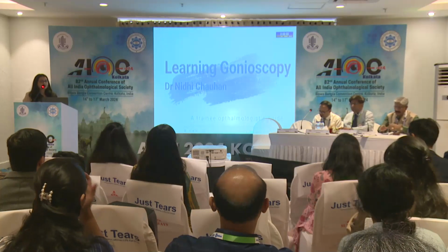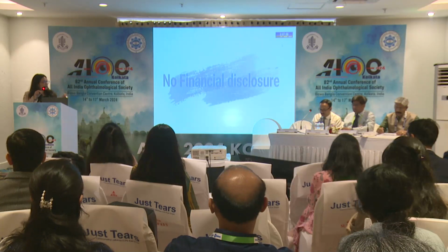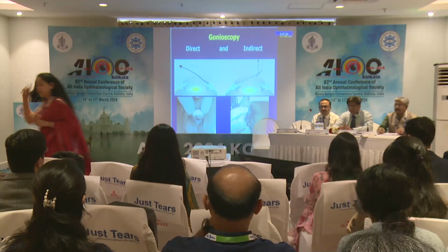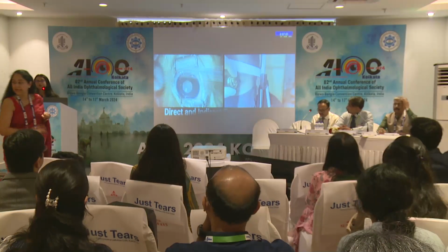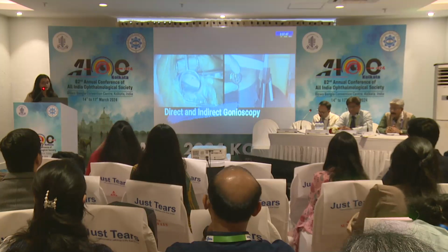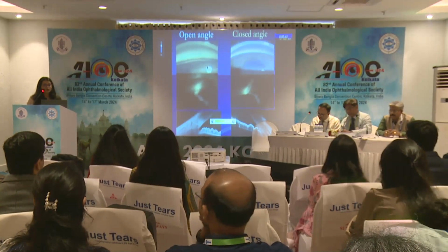Good afternoon, everyone present here. Thank you to AIOC for giving me this opportunity. I have no financial disclosure. We do two types of gonioscopy, direct and indirect. The direct being done intraoperatively, and the indirect gonioscopy we do at the slit lamp. We have to identify whether the angle is open or it is closed.